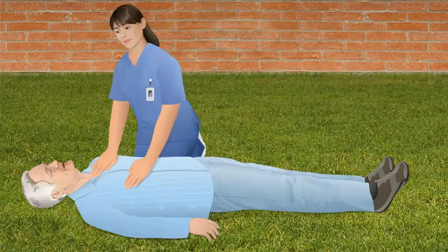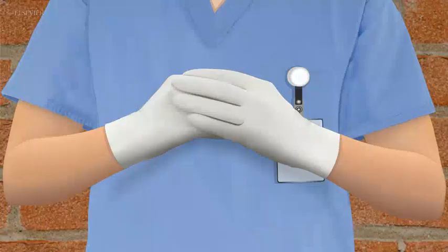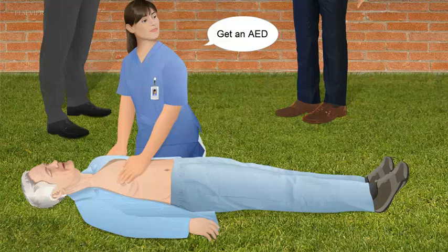Confirm that the patient is unresponsive, not breathing, and pulseless. Perform hand hygiene and don gloves if time permits. Call for an AED and use it as soon as it is available. If an AED is immediately available, start the AED before chest compressions.